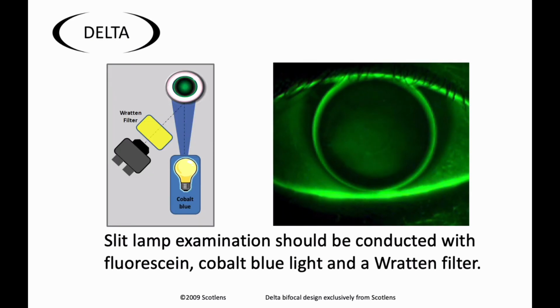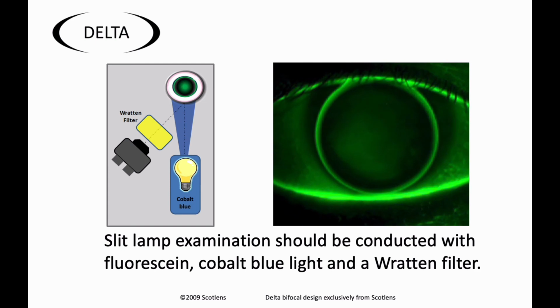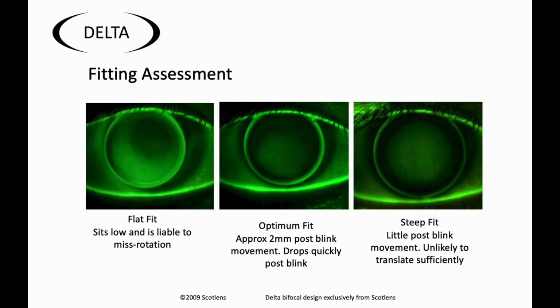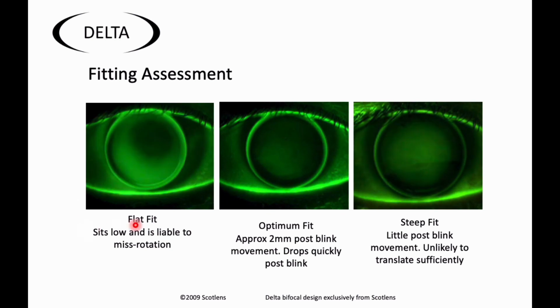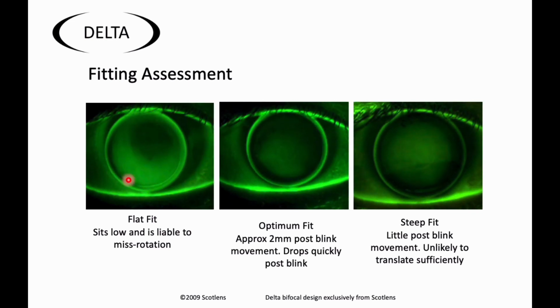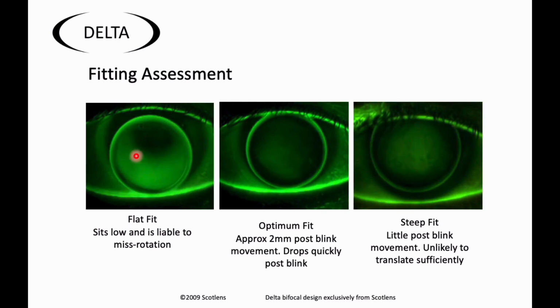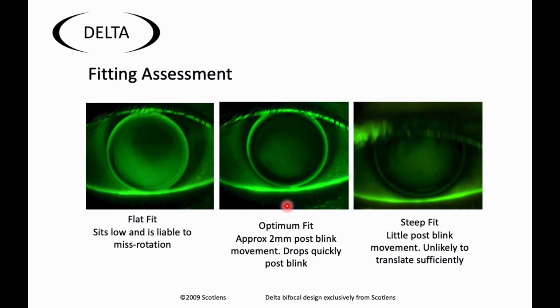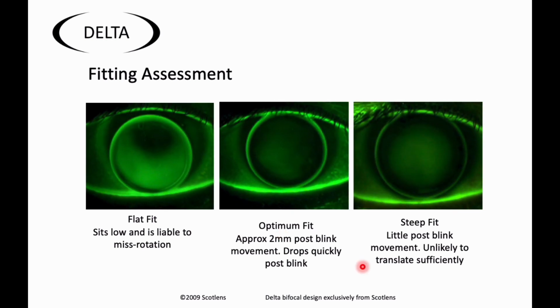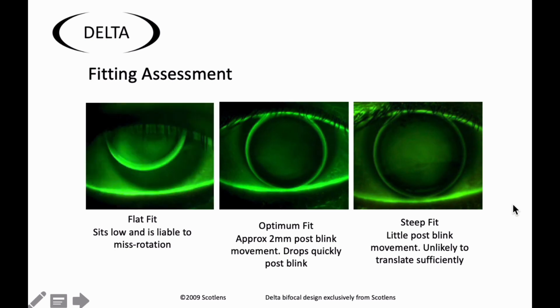Assessment is best done with fluorescein and a yellow filter, and we want to have a lens that moves a bit like the one in the video, nice movement on blink, and a fairly central position. You can see, if we look at the lens on the left, which is a flat fitting lens, that the lens is actually bridging. So we know it's flat because it's bridging between the corneal apex and the peripheral cornea, and we're getting a sort of barreling, slightly C-shaped movement as the lens blinks. So this is a little bit too flat. In the optimum fit, we've got slightly steep pooling in the center, good centration and good movement. And then you can see with the steep fit, we've got hampered movement, so the lens is a bit static, so it won't translate as well as we would hope for.